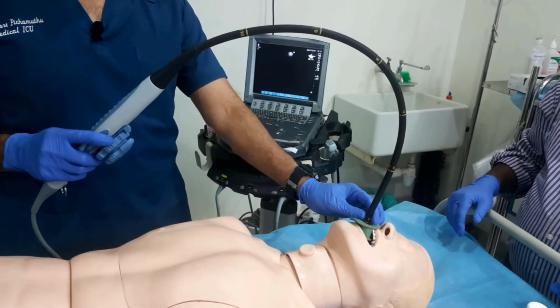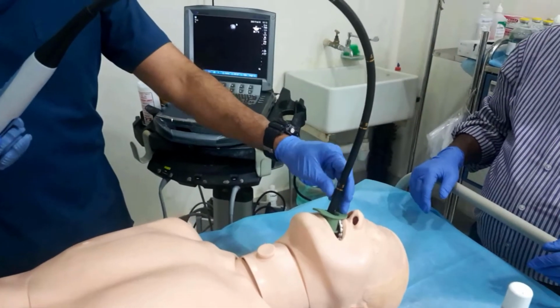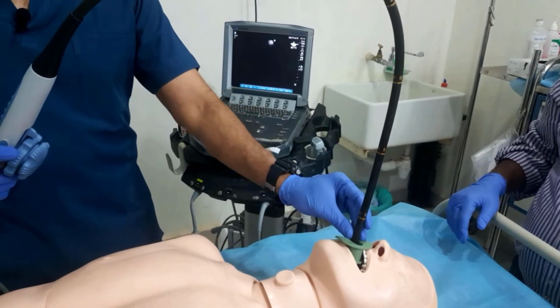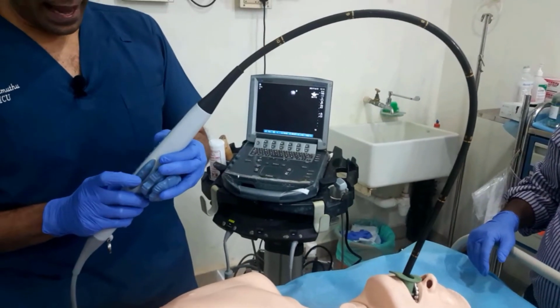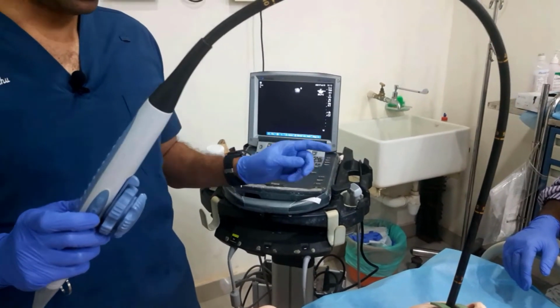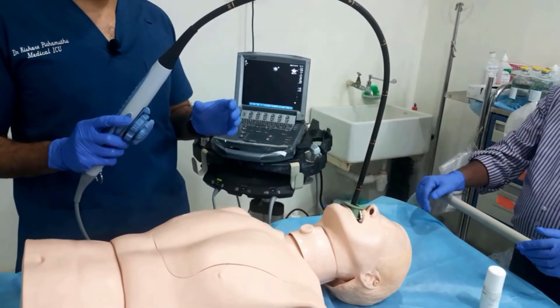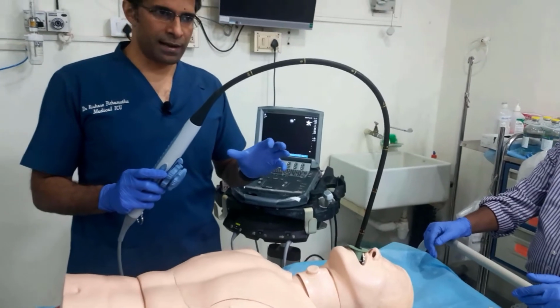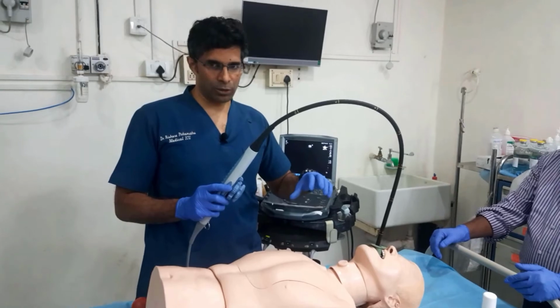After the transgastric long axis view, we now move the probe out, we pull it out, till it's about 35 centimeters at the incisors. Currently, the tip of the probe is in the middle of the esophagus. We also bring the angle back to 0. It was 120 degrees, and we bring it back to 0. Now, this is a very important view. It's called the mid-esophageal 4-chamber view. And this is like the base view, in the sense that from this view, we move to different positions to get different views, and then we can come back to this.